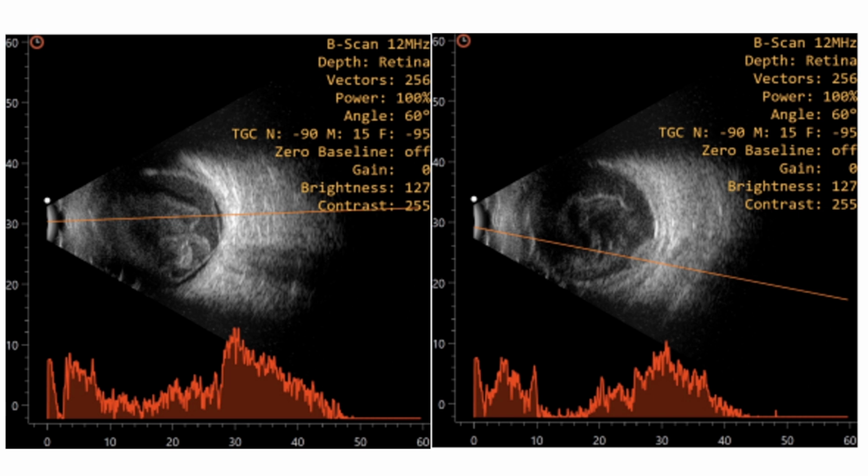Yes, so it's unlikely that it is RD, because it appears continuous with the echoes in the front. If you have RD, then you will have some separation between the vitreous and the RD. So first of all, the configuration is not like RD. Second, the reflectivity is also not like RD. And third, the echoes in the front along with the membrane are also not like RD. Go ahead, Devika.